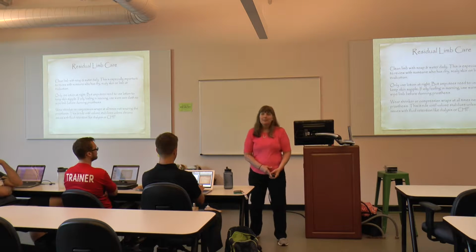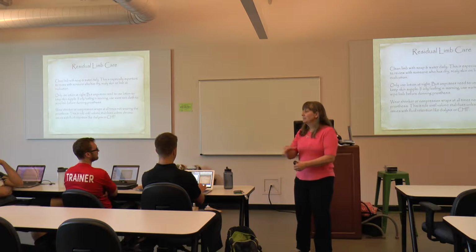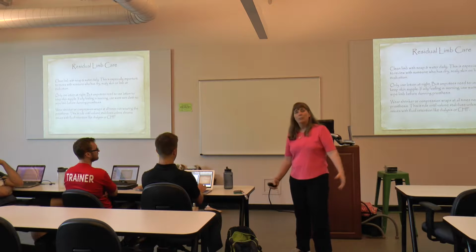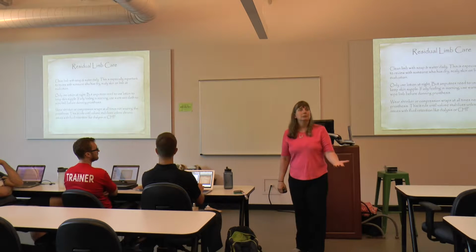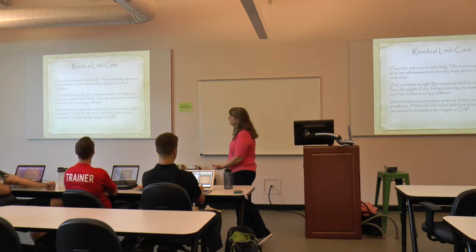You'd be surprised how many times I get a towel, I wet half of it, and I scrub somebody's leg, take the other half and dry it, and how much better it looks. And the patient's like, wow, but you can do this, guys. This was not rocket science. Make sure they know to do that.